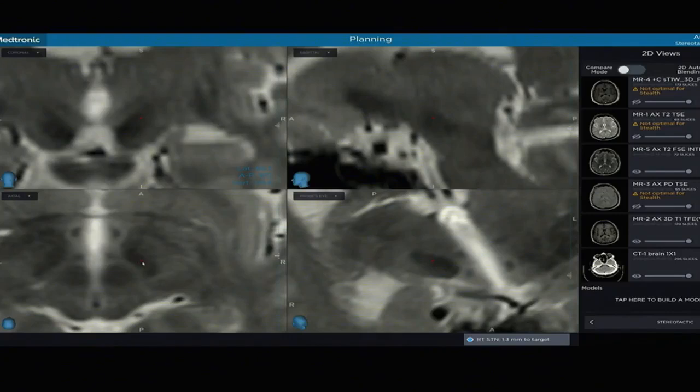and to look to see where that lead is. And if we like where it is, we're good. And so we've done a lot of studies looking at that, and our outcomes have been very strong in that regard. But I don't think one's better than the other. I think it's gotten to a point where it's almost like surgeon preference.